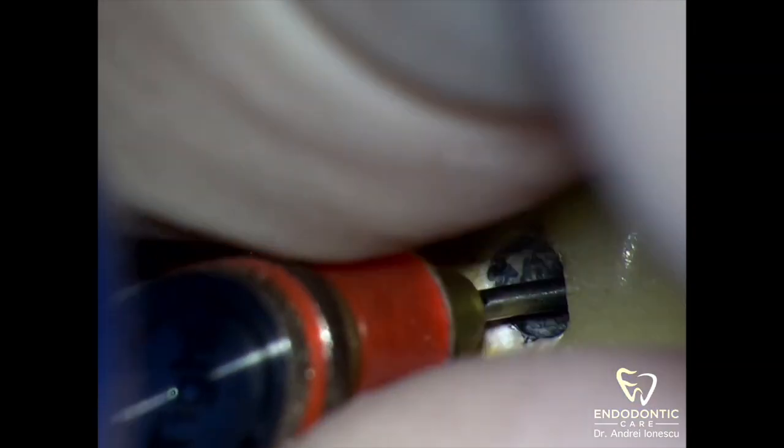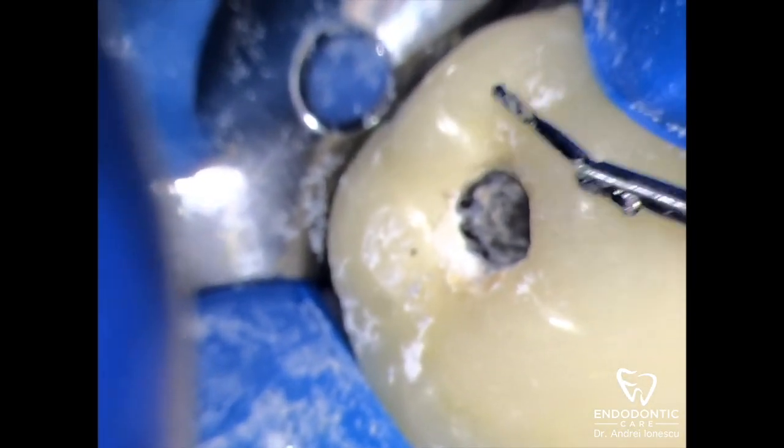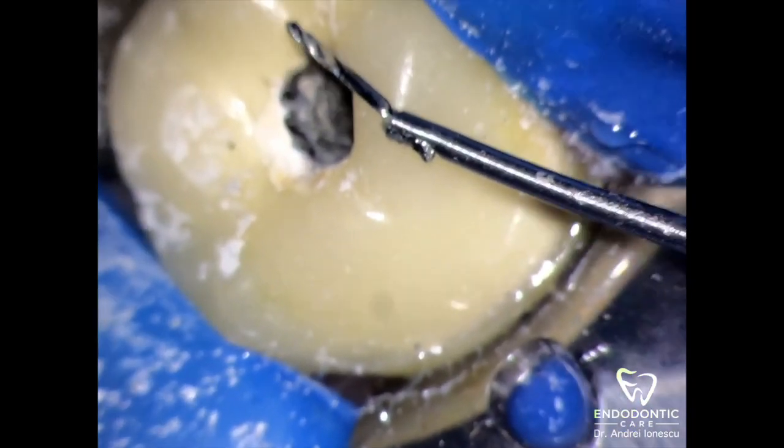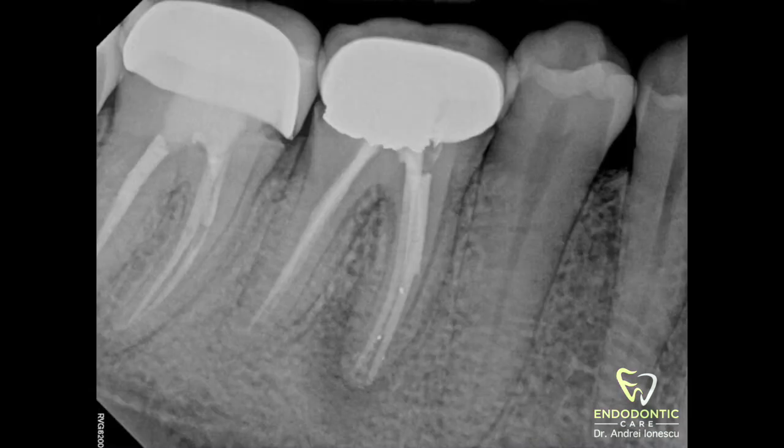In this case I was quite surprised by how much force it took to remove this instrument. After the screw wedge became engaged, I had to apply so much force that I was worried the handle was going to come off the IRS — but thankfully the file came out. That about wraps it up. From here we just need to clean, shape, and fill these canals, and follow up with the patient long-term to see how it heals. I've placed a link to the IRS system as well as the instruction manual in the comments. If you have any questions or anything else you want to chat about, please leave a note below — thank you.